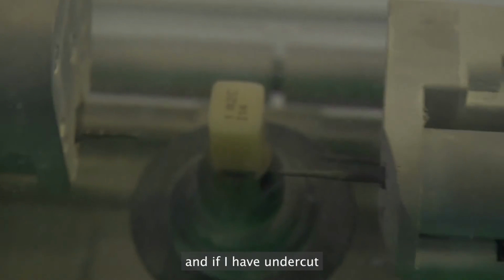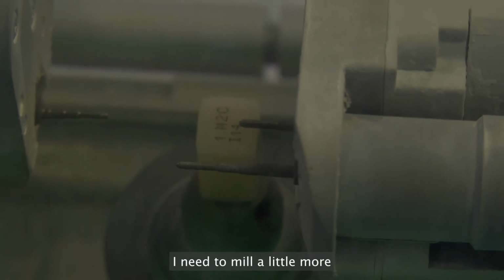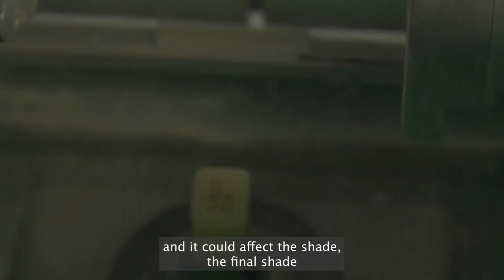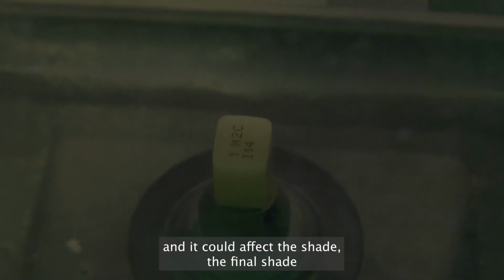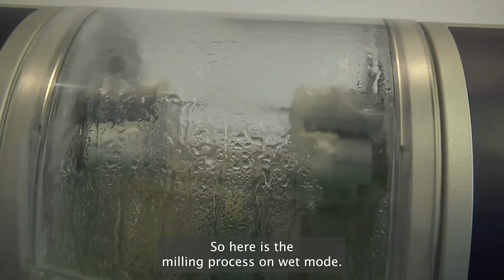And if I have an undercut inside my crown, my preparation, I need to mill a little more, and it could affect the final shade. So here is the milling process in wet mode.